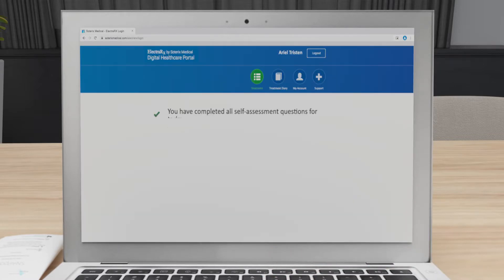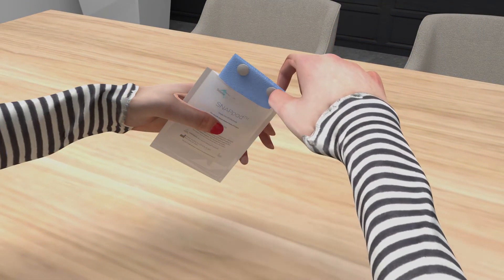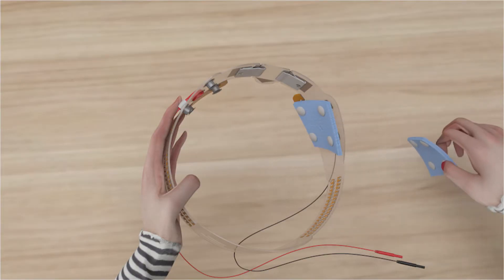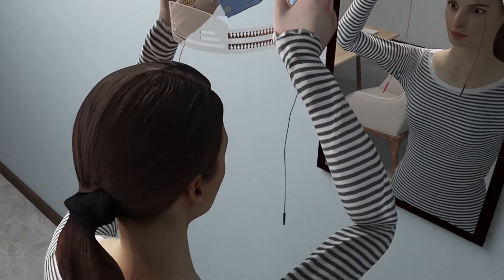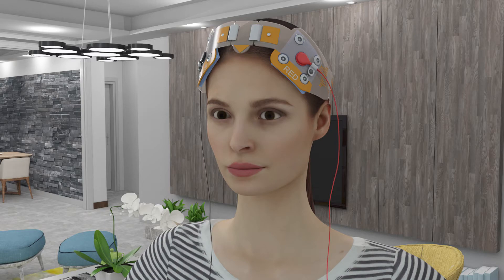Then, follow the on-screen instructions to retrieve your stimulation code for the day. Take out the SNAP pads from their packaging and attach them to their designated locations on the SNAP strap. Once the SNAP pads are properly attached, place the SNAP strap on your head as per the instructions given by the doctor.